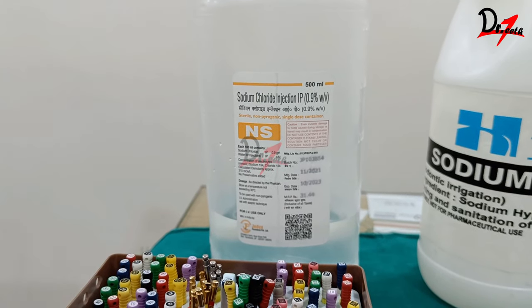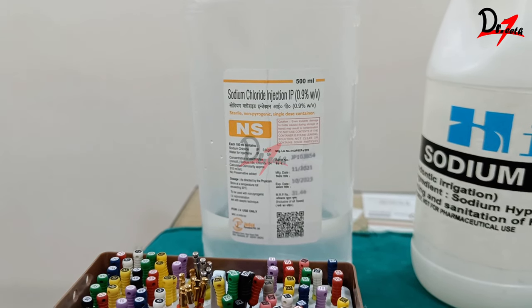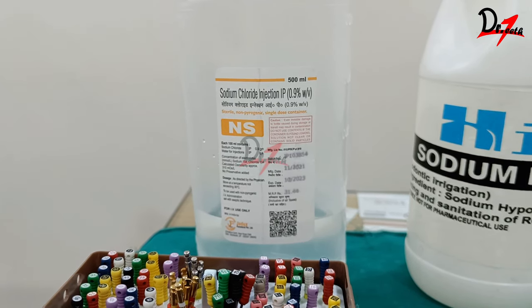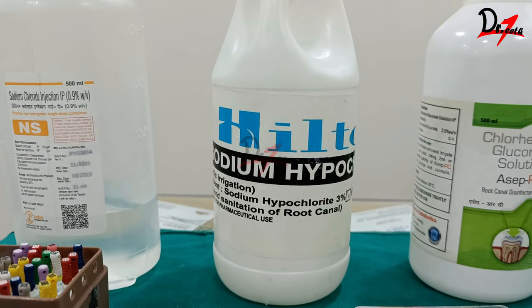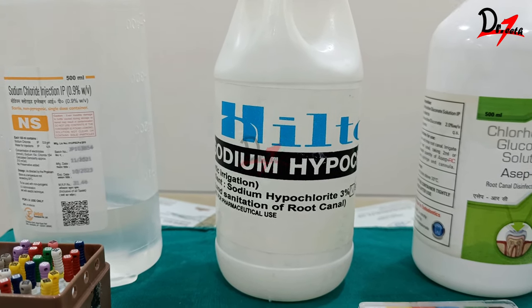You can flush the sodium hypochlorite with normal saline. Normal saline does not have any antimicrobial efficacy and is only used for lubrication, to flush out other irrigants, and to keep the canal wet — because we perform biomechanical preparation in wet canals only. Sodium hypochlorite has tissue-dissolving ability and also removes the organic portion of the smear layer.